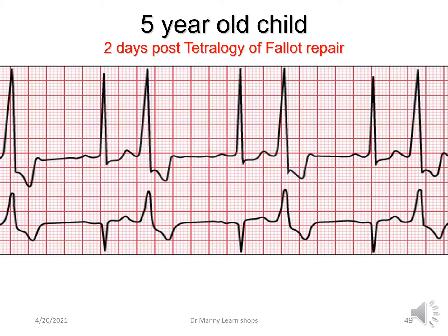Now you've got a 5-year-old child who's 2 days post-tetralogy of Fallot repair. They're probably, and should be, in an intensive care, a cardiovascular intensive care. They're being monitored.